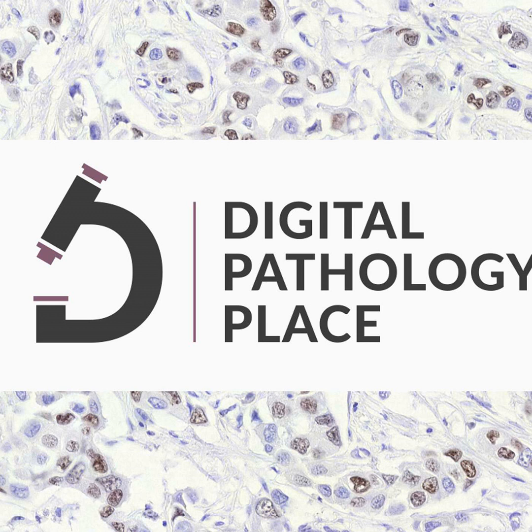1. Supervised learning. This is the most common type of machine learning. In supervised learning, the machine is trained using labeled data. This means that each piece of training data comes with a corresponding output value, often referred to as label. For example, in a task to categorize images of cats and dogs, each image would be labeled either as cat or dog. The machine learning model will use these examples to learn the features that distinguish a cat from a dog, and then apply this learning to unlabeled images in the future.